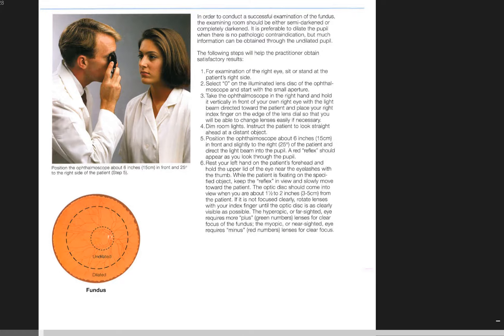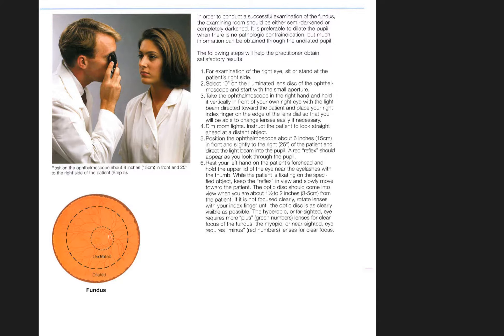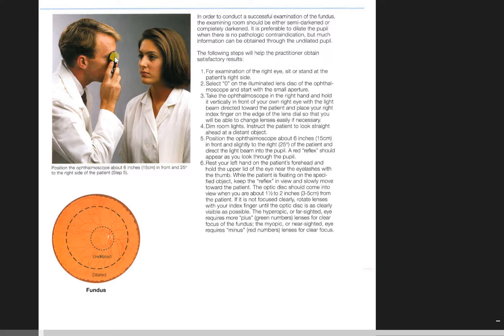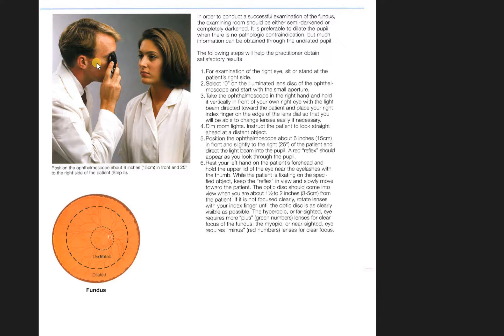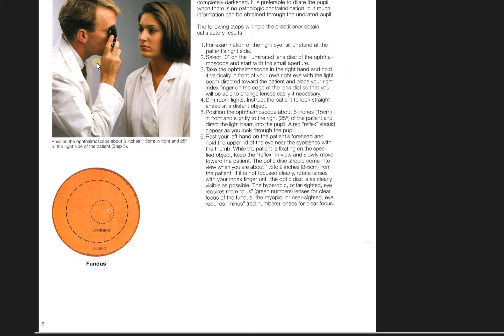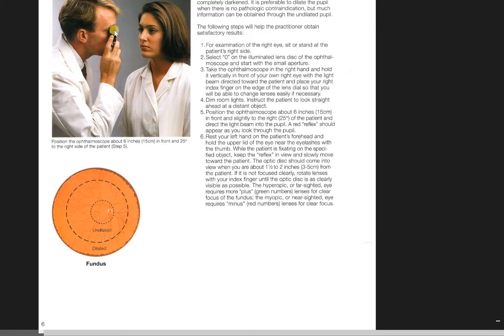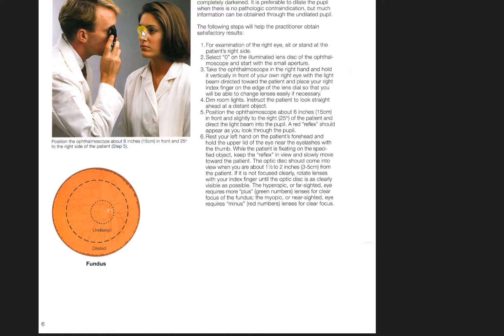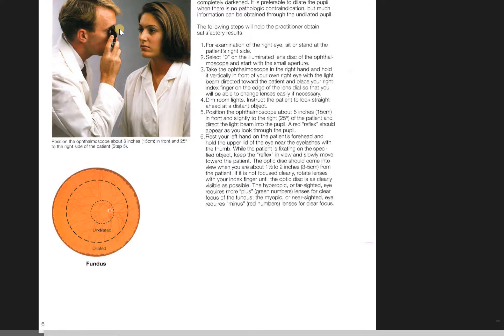What you want to do — at least for me with my patients — when I look in their eye, I dim the light in the room because that dilates the pupil. Then I have them look at a certain spot on the wall so their eyes are pointing in a certain direction, which sets me up with an advantage to really look back to the fundus of the eye. You turn the light on, look through it, get the red reflex — kind of like the red eyes you get in a photo. When you see that red reflex, you carefully go in, go closer, not losing that red reflex until you see the back of the eye.